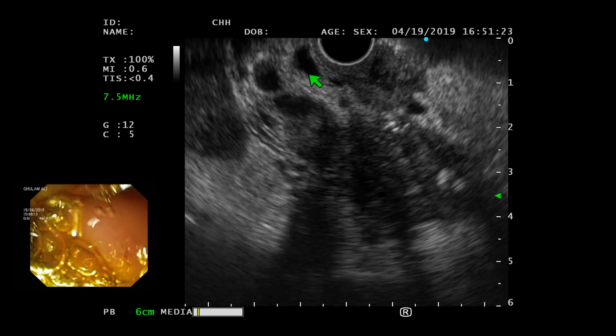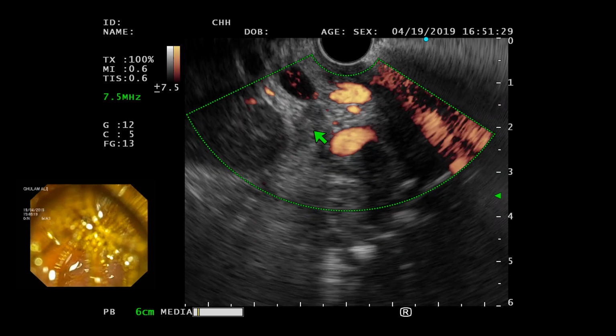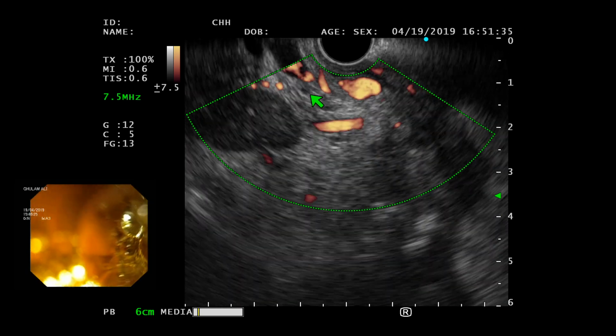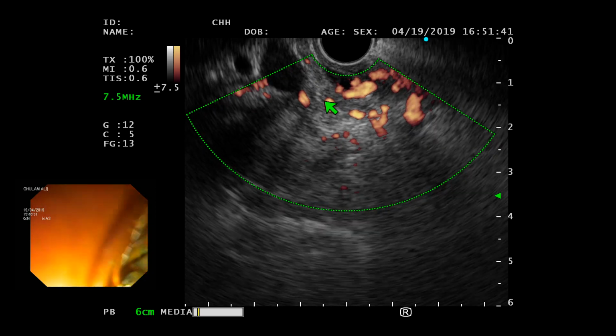ये duct आ रही है ना ऊपर. Duct ऊपर and portal vein here. ठीक है, मैं Doppler उसका डालूं. Right here, actually that is duct there. Is it a duct? नहीं, it is. अच्छा, होता ये है कि कई दफ़ा वो पीछे से आ रही होती है. बिल्कुल, ठीक है. So sometimes that happens.